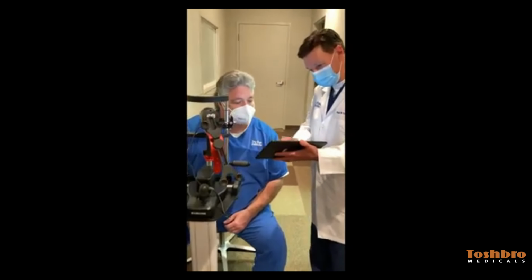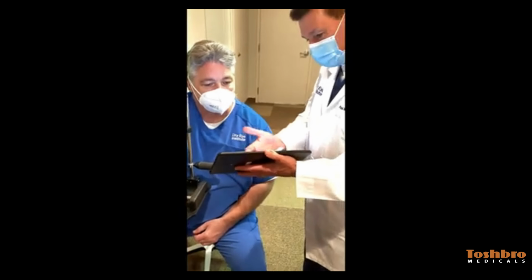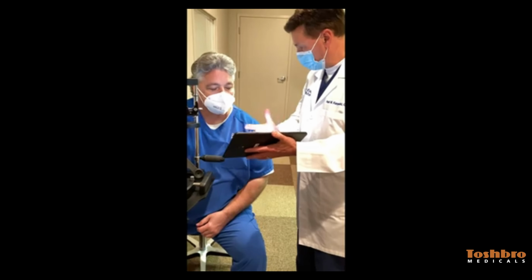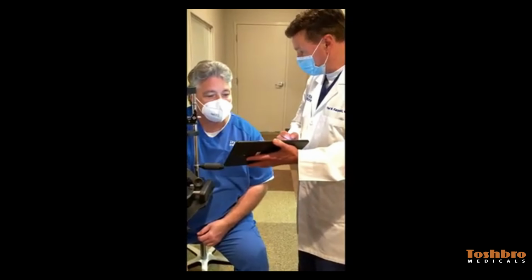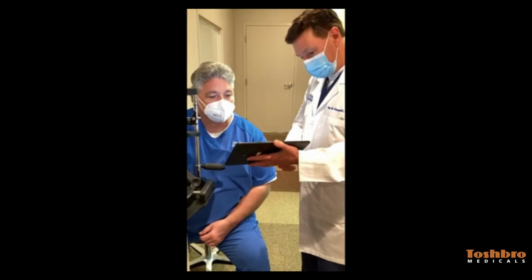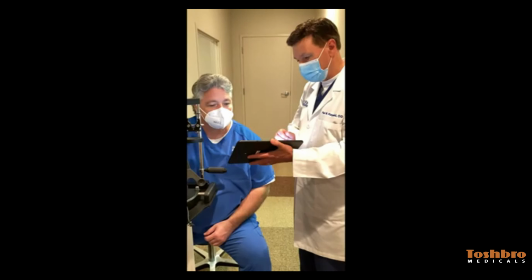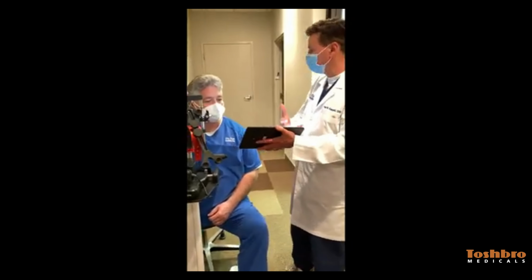And what I'll do here is I'll just explain to you what they should look like. In actuality, what we're seeing, and these are very healthy meibomian glands. You see there's an entire array of glands. That's a really good sign. These little dark areas, though, tell me that there's likely some stress on these glands. So this would be a good case where we would want to take perhaps some preventative measures to ensure your meibomian glands continue to function. And many times we see symptoms present before the signs.